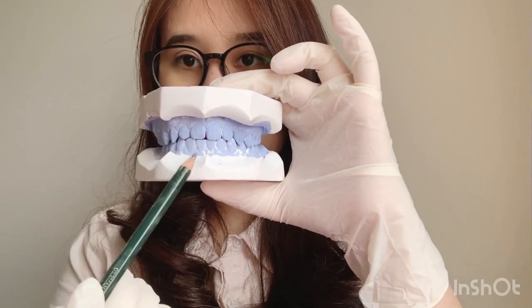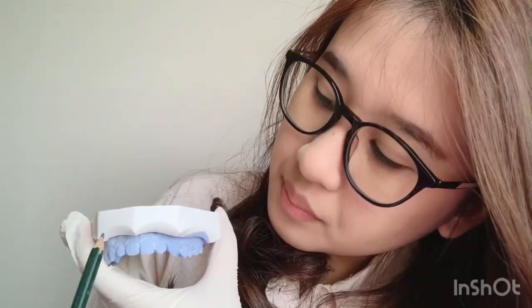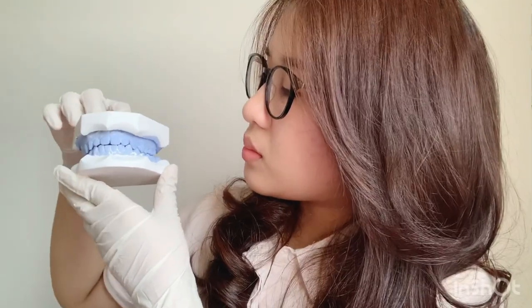We almost finish, and the last step is we make a curved line at the base to show the anatomical landmarks to make them more clearly visible from all sides. The very final step is to check whether the upper and lower teeth are occluded or not. In my study-based model, the results are occluded and not shaking, so I think I made a good study-based model for the clinical exposure practice.